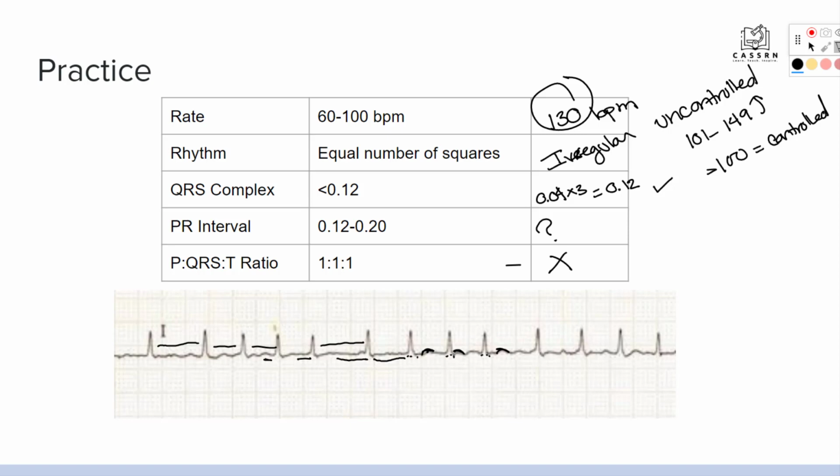Okay, and we did state earlier that your rate could be between 300 and 600. So this is an example that might not always show up in the EKG. However, this just means that our AV node is doing what it's supposed to do, because our atrial rate would easily be between 300 and 600. But in this case, this is our heart rate that's showing up on the ventricles. And so these are our ventricles that are beating, but they're still beating really fast. We can see that it's irregular. There's not any regularity if we were to look from each R interval. And then our QRS complexes are normal spaced, but we are unable to see any kind of P wave because we're not getting correct depolarization and repolarization of the atria.